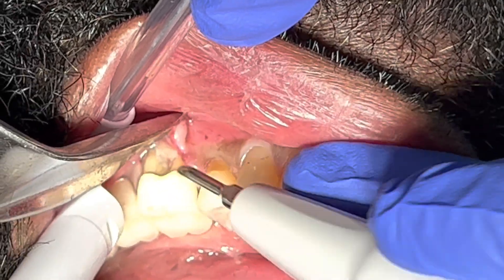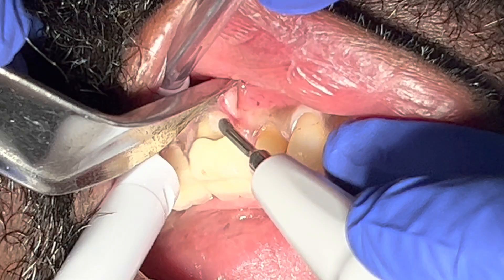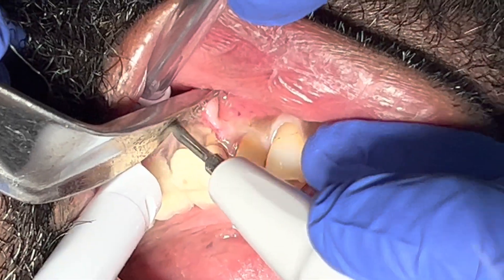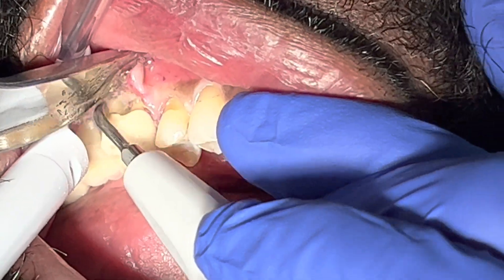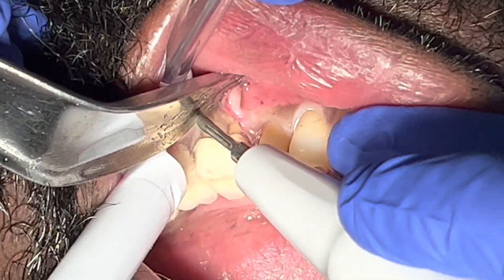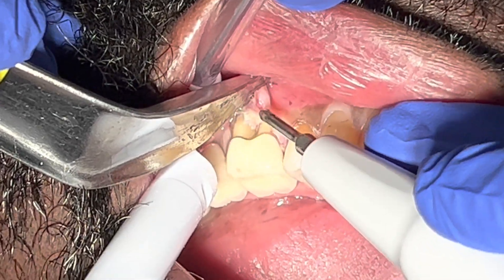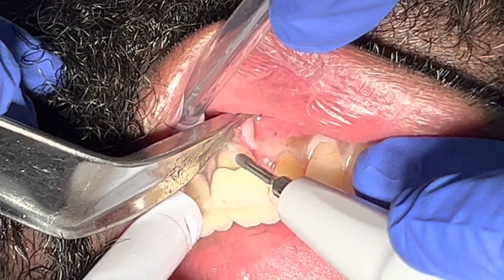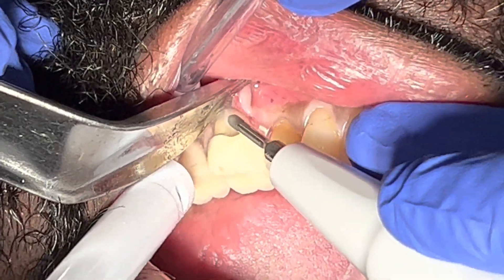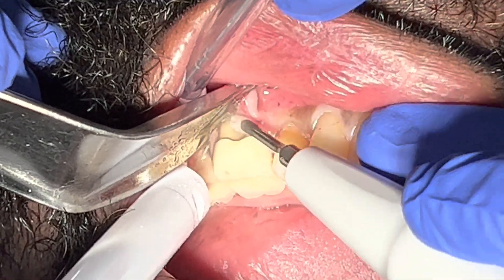It's a little hard to see what's going on during this procedure, but I was wearing 3x magnification to clean. This is the bone we're recording. It may not be very clear on video, but I have a very nice site with the defect alveolar bone right there, and I'm trying to go as deep as possible to remove any calculus target.